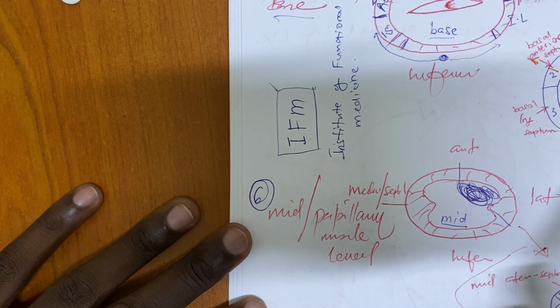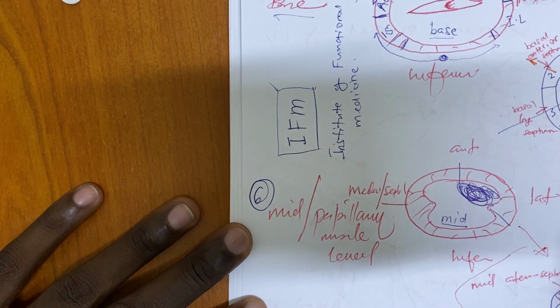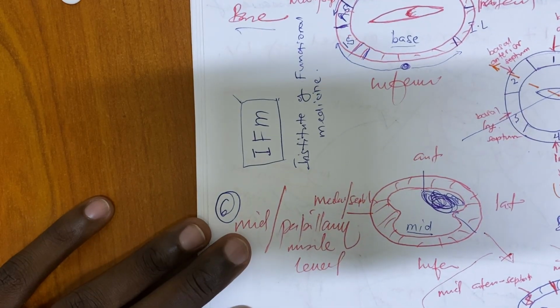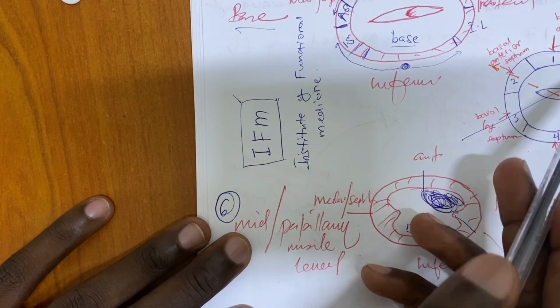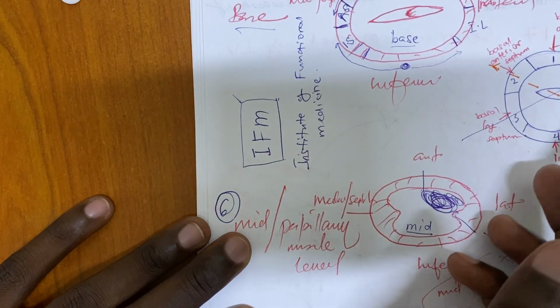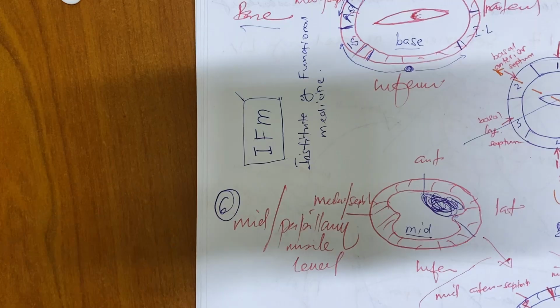If we draw a line, where has it passed? It has passed through anterolateral and inferolateral. You can't draw a line like going straight across. No, you want diagonal, because that is how the beam is sent. The beam is diagonal.